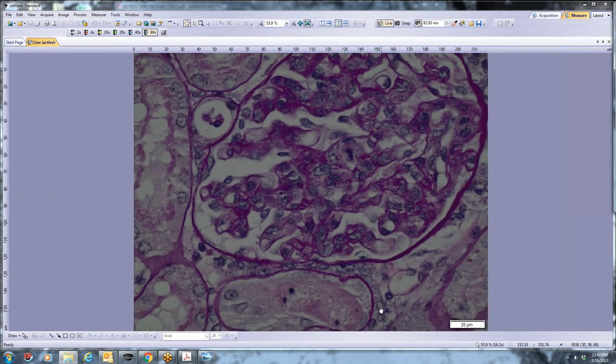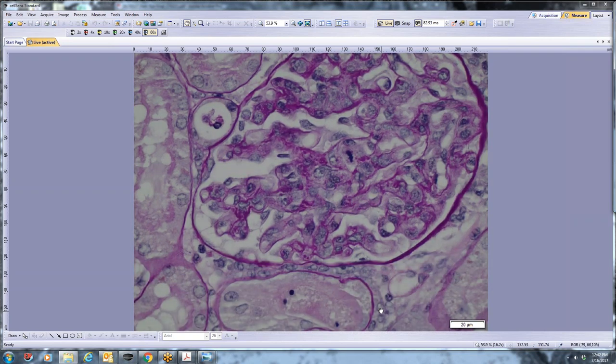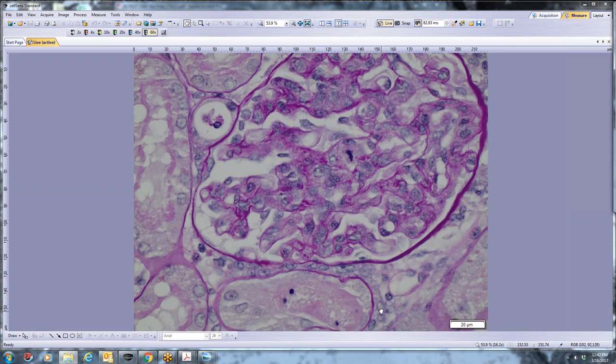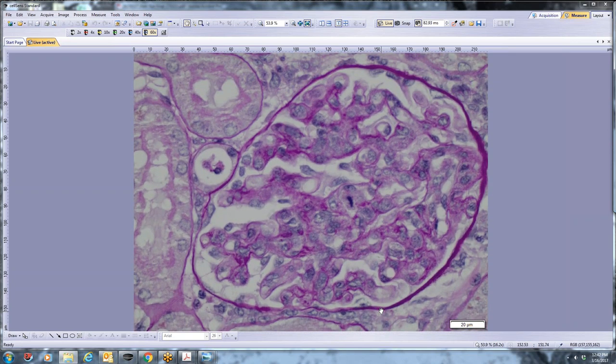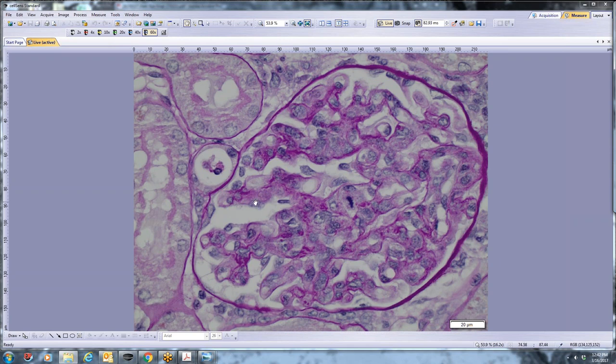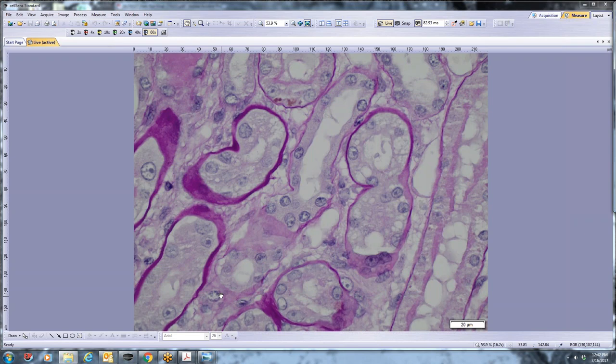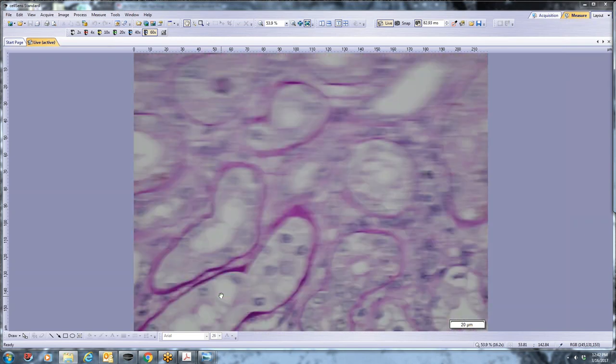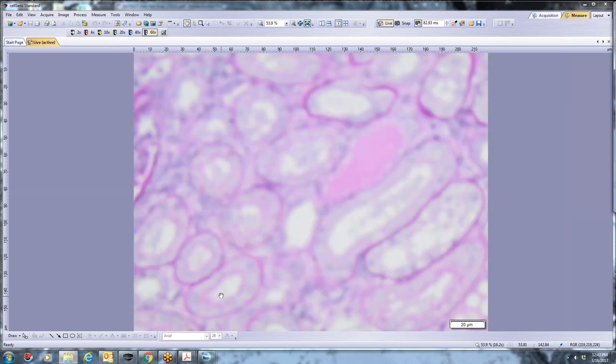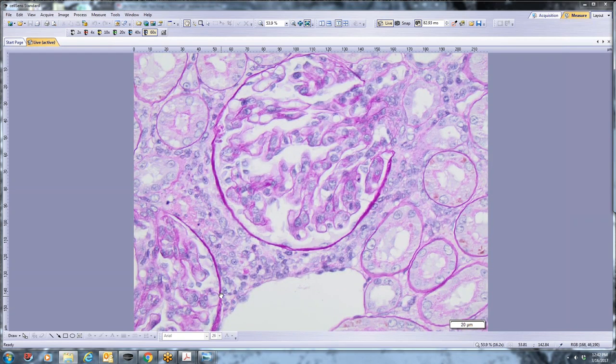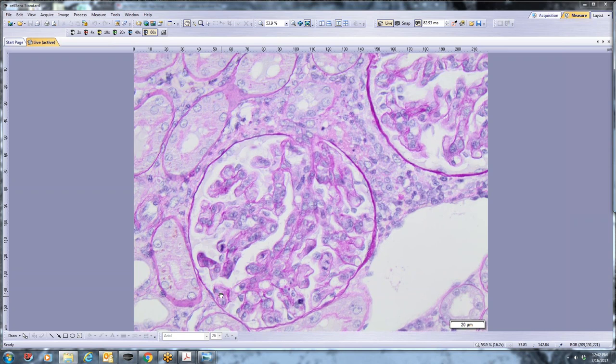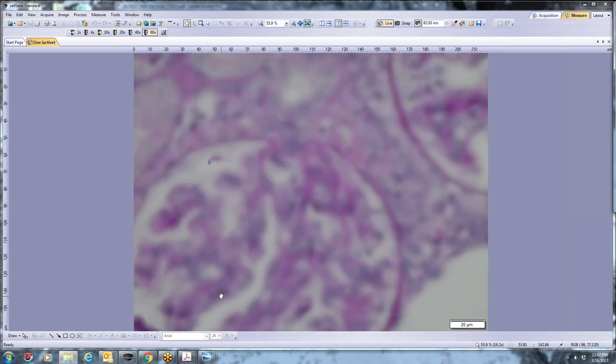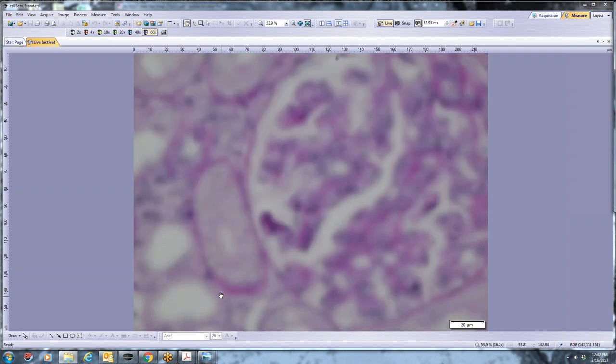And then the gorgeous glomeruli. This one has a mitotic figure. I have no idea how. It might be inside a capillary lumen, but that's strange. So the hypercellularity is quite still apparent, but if you again look at this GBM, it doesn't look awful. There are areas that would have scarred down, but in general a lot of the GBM is a fairly normal thickness. So this was more of a proliferative pattern compared to the other case.